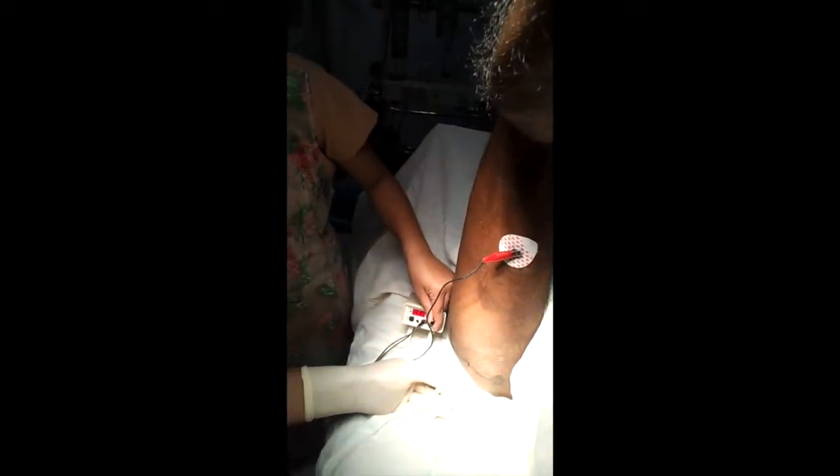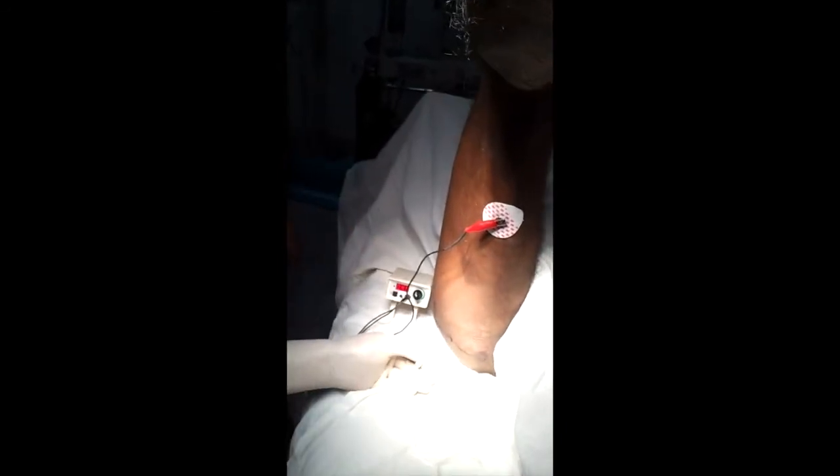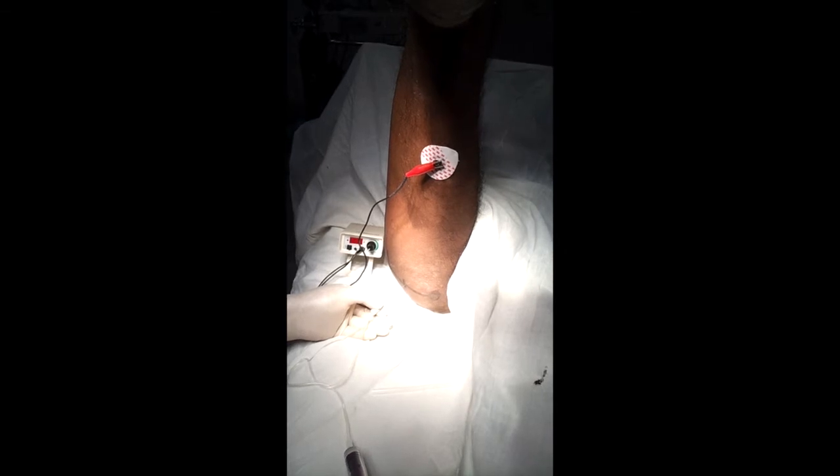Plantar flexion — reduce, reduce, reduce. There is no contraction at point three six. Now increase — we are at point four four and we are getting the contraction of plantar flexion.